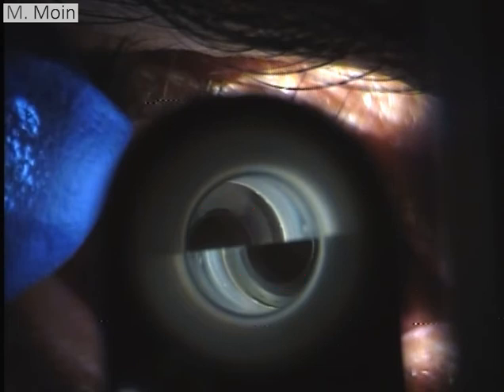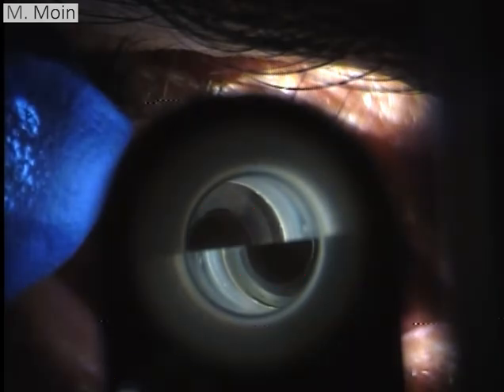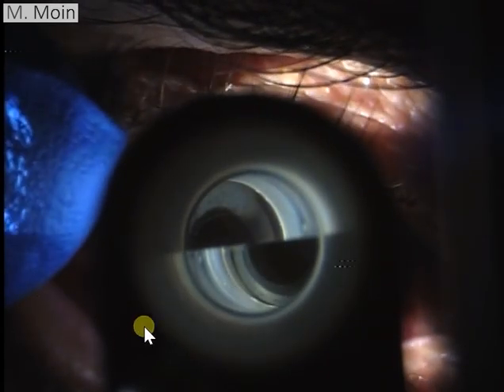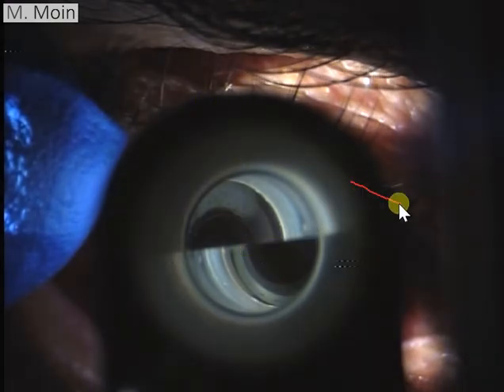So this patient had an intraocular pressure of 16 post AGV valve, which was pretty satisfactory for this patient. So you just need to touch those wires. Sometimes people, if this is the tonometer, they would go in, and if you're looking from the side, it should just touch the cornea. It should not indent the cornea.